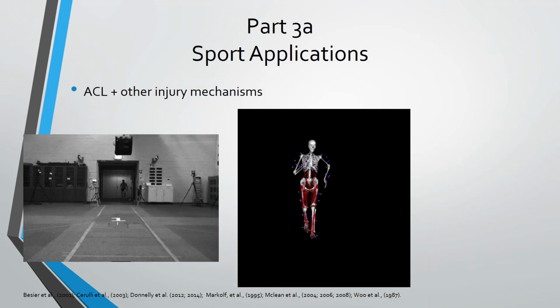So the investigation of injury etiology is an increasingly relevant and important area of research, gaining more and more attention. ACL injuries, for example, are extremely common and place a huge burden on both individual athletes and sporting teams, as well as the national healthcare systems. Now, through the use of force plates and marker-based motion capture, we are learning more about ACL injury patterns and from this able to formulate prevention strategies.